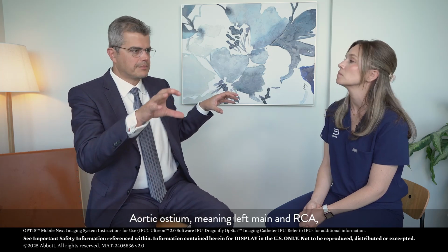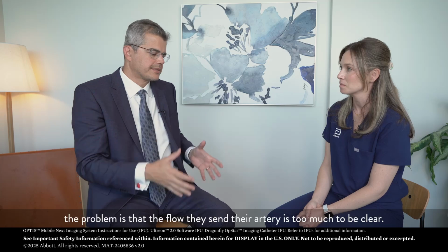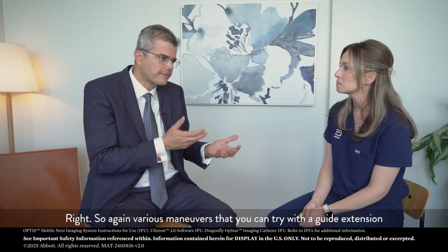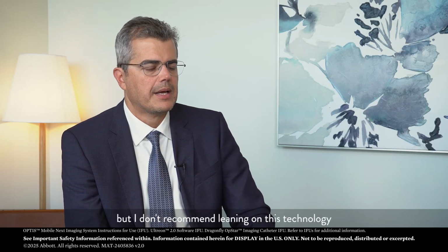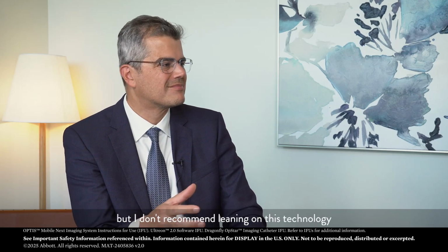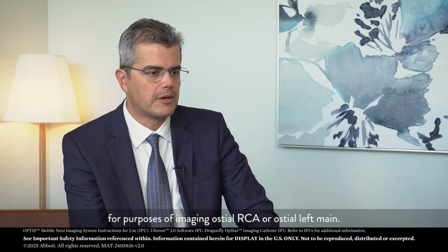Aorto-ostial, meaning left main and RCA, the problem is that the flow in the ascending aorta is too much to be cleared, right? So again, there are maneuvers that you can try with a guide extension, but I don't recommend leaning on this technology for the purpose of imaging ostial RCA or ostial left main.